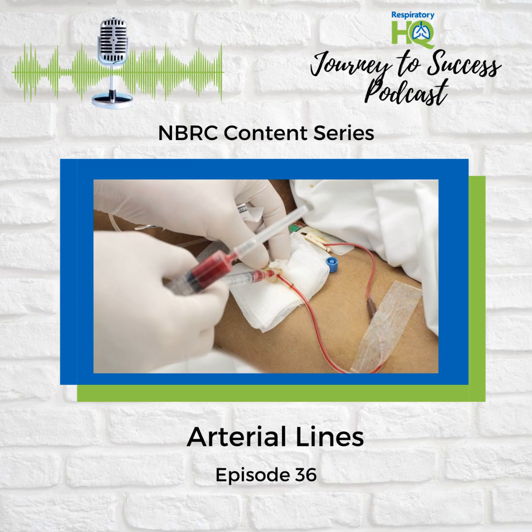But if the patient has circulation problems in their hands already, then a different site might be better. So it's like choosing the best route, based on the individual's own roadmap. Exactly. And in emergencies, the femoral artery is often used because it's bigger and allows for quick access. Makes sense. And you can do rapid fluid resuscitation if needed. So each site has its own pros and cons. For sure. And as the source emphasizes, each site comes with its own hazards. We talk about embolization, but there's also infection, bleeding, and even accidentally injecting meds meant for a vein.